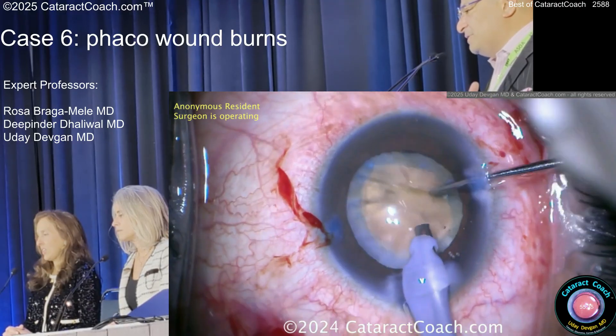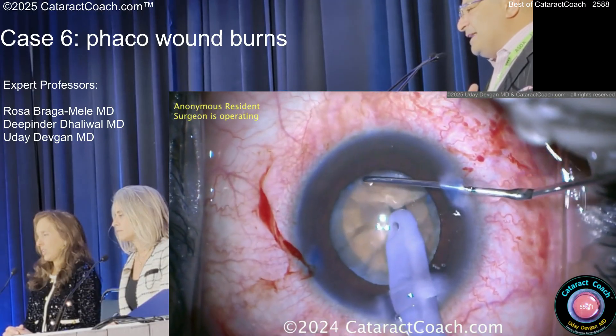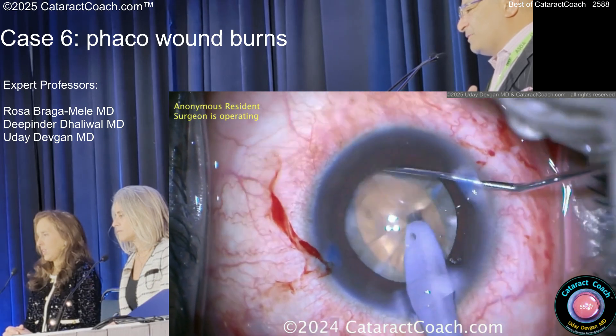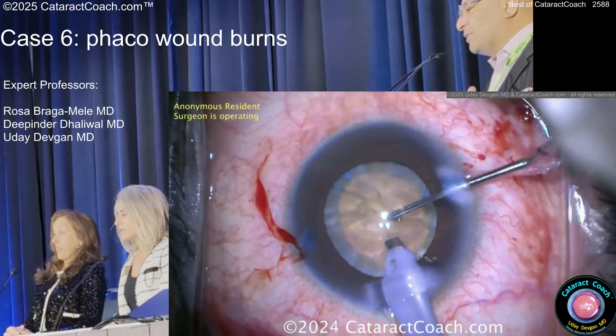The needle is not in the middle of the sleeve — it's shoved up against the side of the incision. You've got a white cataract, barely getting any kind of FACO done, buzzing a little bit and still getting nothing. And now, just cooking the cornea.